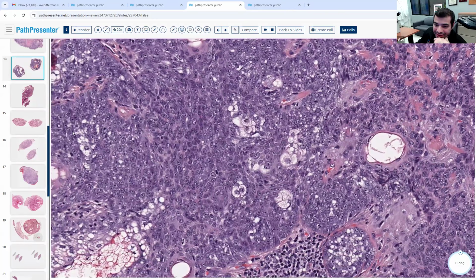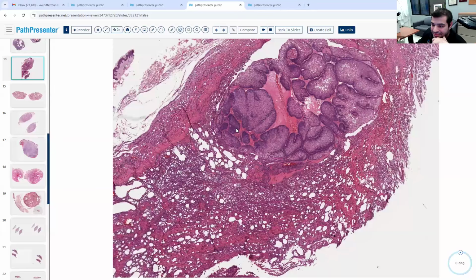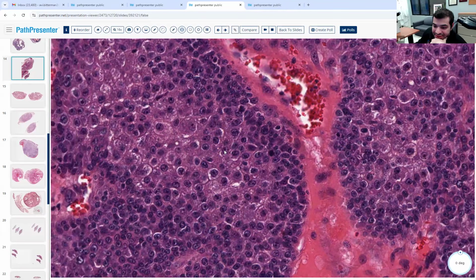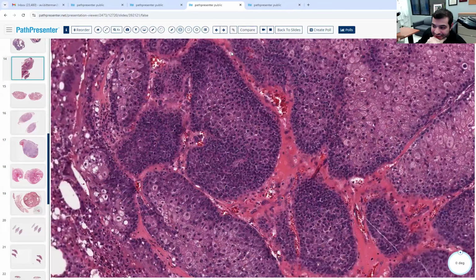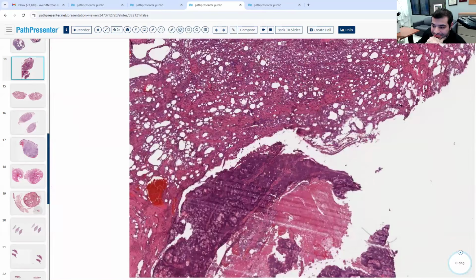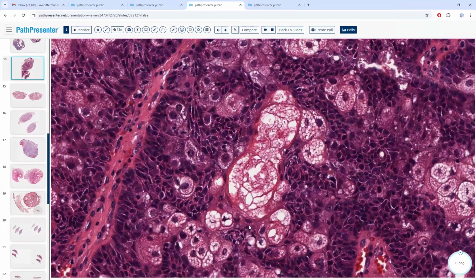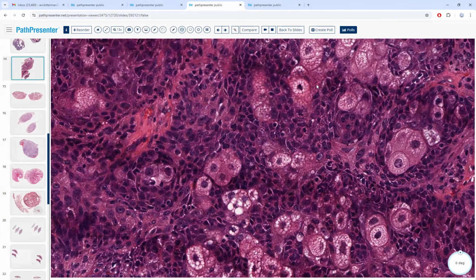Okay, get a good look at that. That's normal. What's different about these nuclei? Or these nuclei, if I go down to the... They're really hyperchromatic, and you really don't see the scalloping that we see in the previous ones. They're really condensed in some areas.